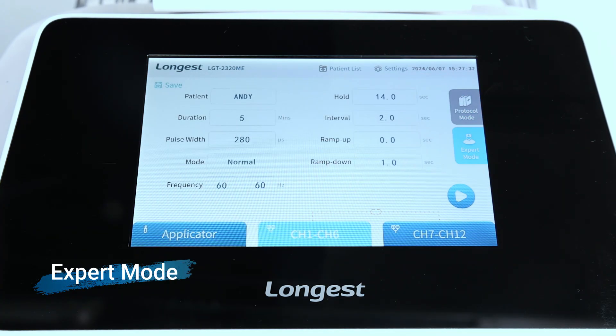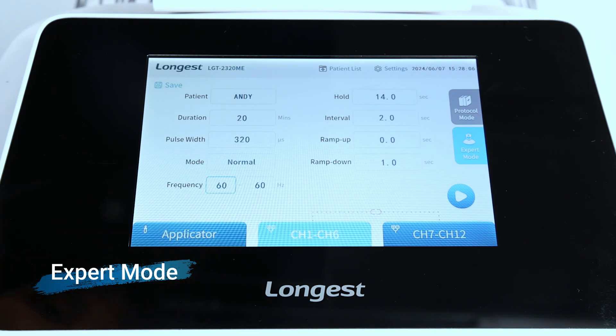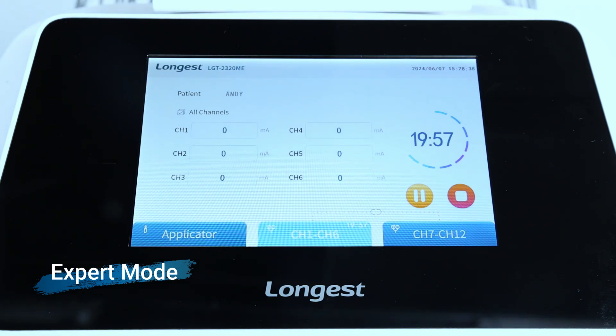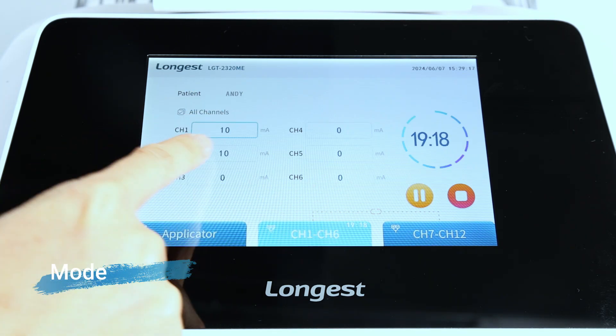Click the export mode button to customize parameters for the treatment. There are four frequency modulation modes: normal, sweep, random, and alternate. Then click the intensity boxes and adjust the intensity using the rotary knob. After completing the parameter setting, press the start button to start the treatment. Start with a low intensity, gradually increasing to a comfortable level.